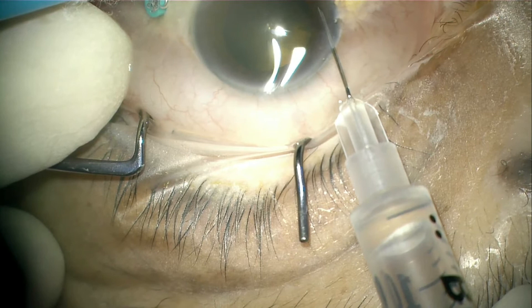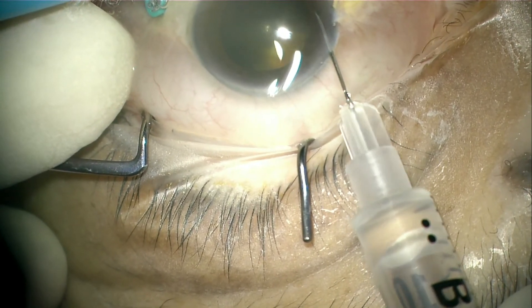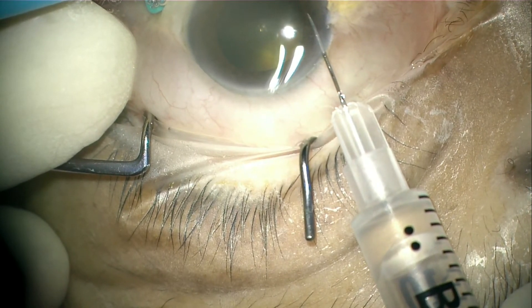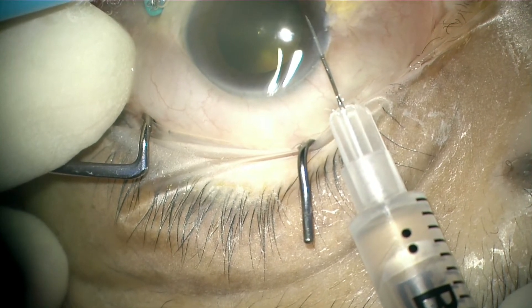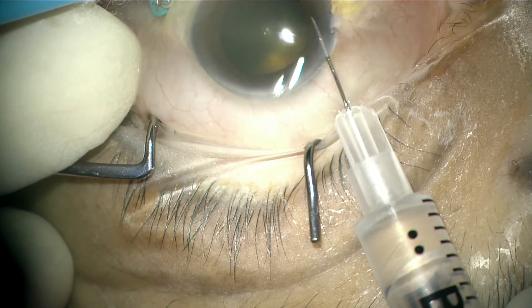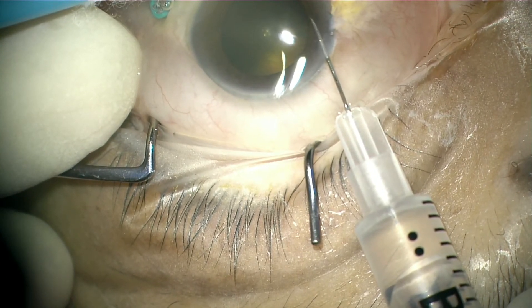Avoid directing the needle directly towards the center as it might hit the lens. Once in position, slowly the left hand will apply some pressure on the other end to passively push the aqueous into the empty syringe. At the same time, get the assistant to observe the amount of fluid withdrawn from the eye. Keep an eye on the tip of the needle, avoid injuring the iris tissue which may cause bleeding, and make sure the anterior chamber is stable at all times.